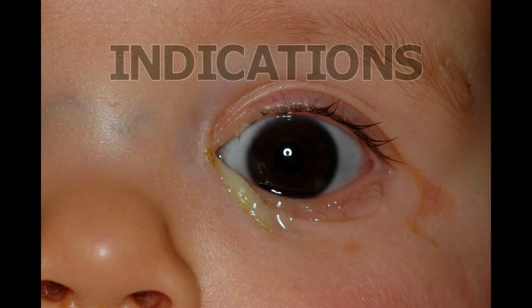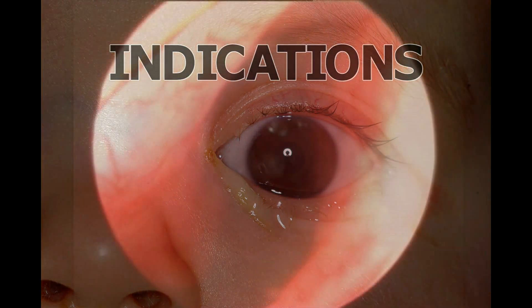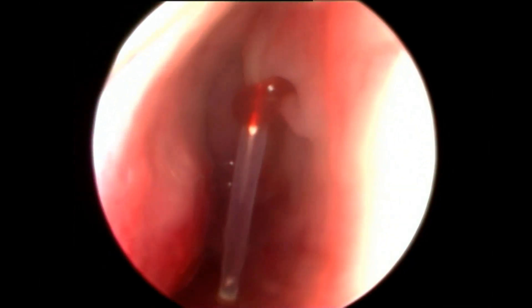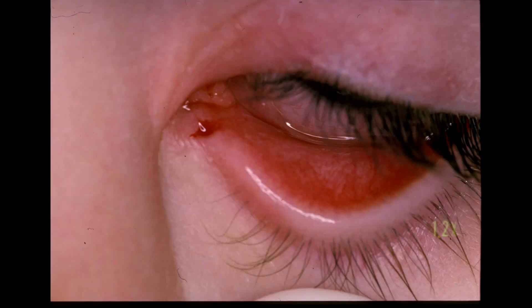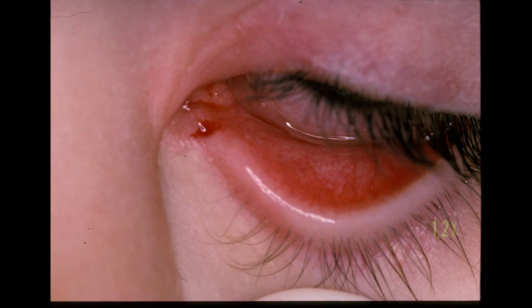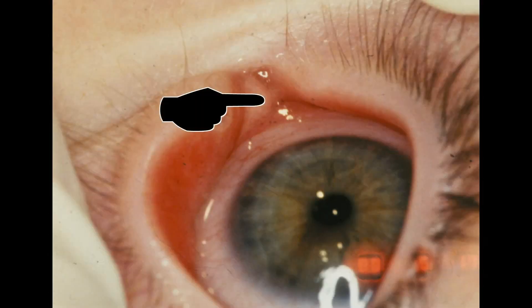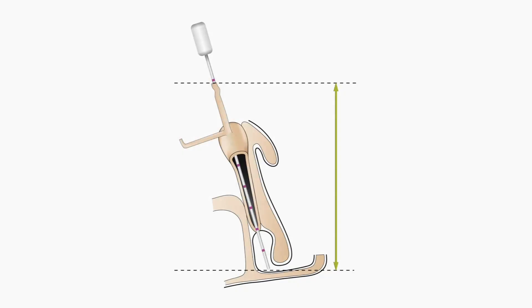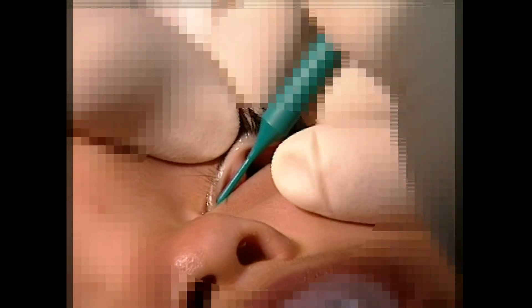The principal indication for the Master Ka pushed intubation technique is treatment of simple mucosal obstructions in the nasolacrimal duct, most commonly at the valve of Hasner. It may also be considered for repair of canalicular trauma, canalicular agenesis, or DCR procedures in certain instances. The Master Ka is an excellent alternative for stenting simple congenital nasolacrimal obstructions at any age, whether early or very late.